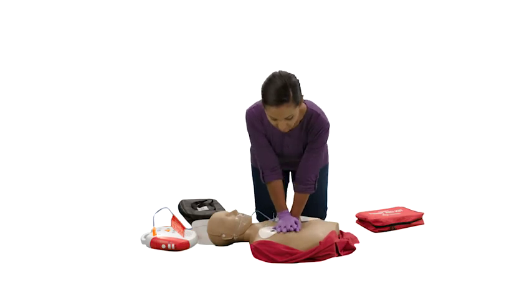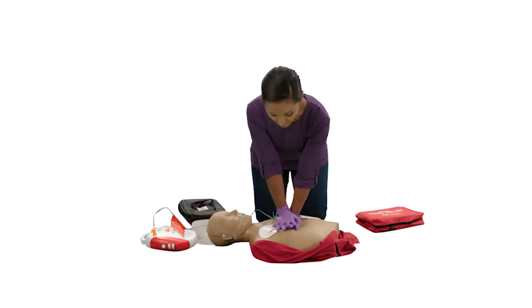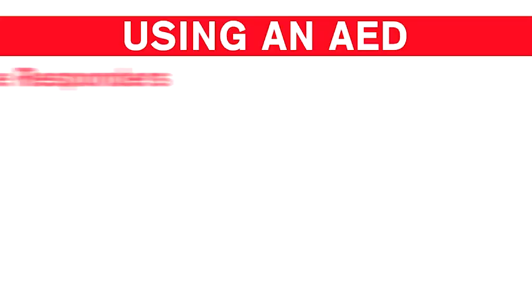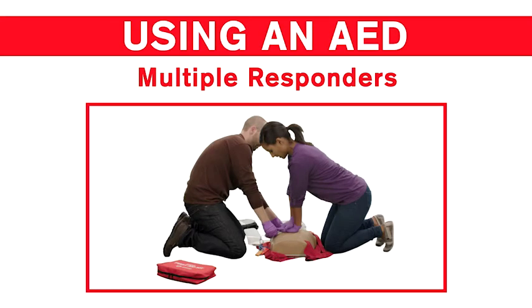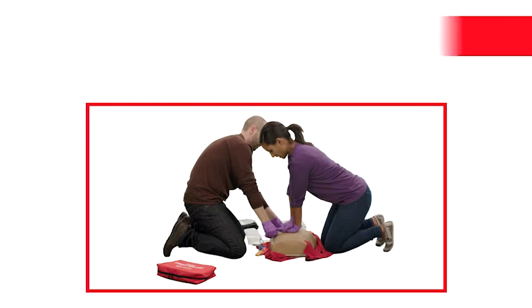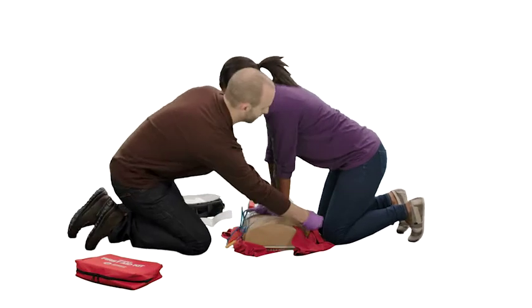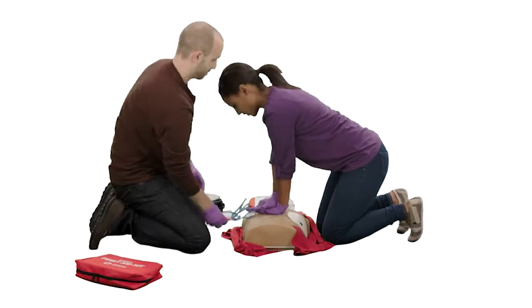Continue giving CPR and following the AED's prompts until you see an obvious sign of life or EMS personnel arrive. If there are 2 or more responders, the steps will be slightly different. Responder 1 will continue CPR, while Responder 2 sets up the AED.